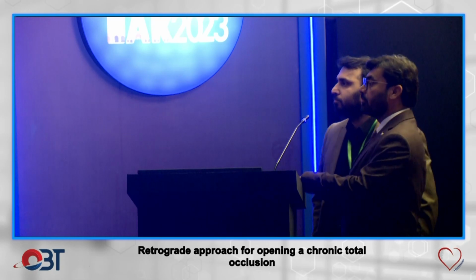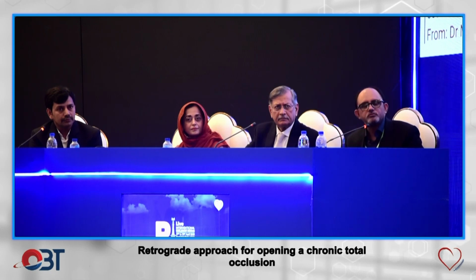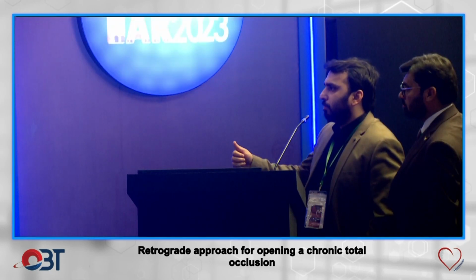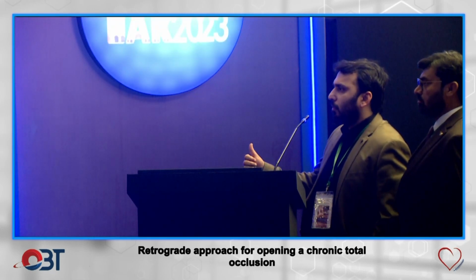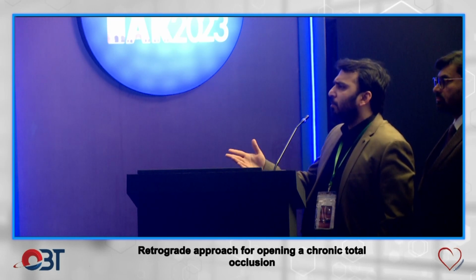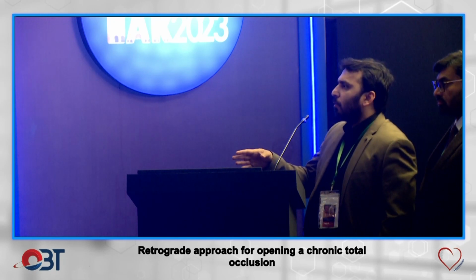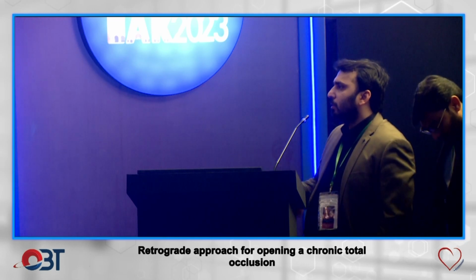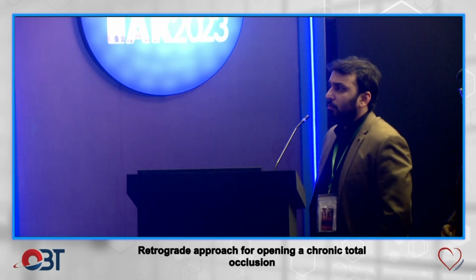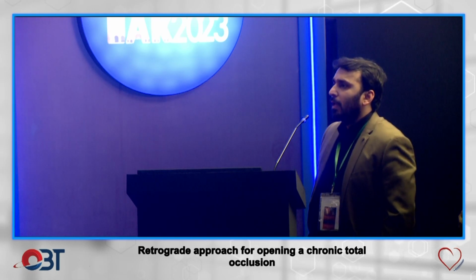Sir, one question. Your antegrade wire crossed the lesion, and how did you figure out that this is extraplaque, not intraplaque, not intraluminal? Obviously, I have shown only one clip for both Pilot 200 and Gaia 3. If I were to show the whole case, it can easily be seen because there were other wire placements as well for the Gaia where it was very clear that it is going extraplaque.